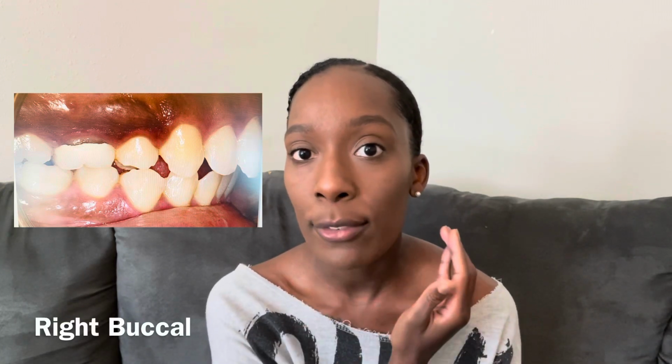In this image, it's really important that you're getting, starting from the cuspids to the second molar, so you can see everything. Sometimes it's really hard to get that shot, so we do have cheek retractors that are shaped this way so you can pull all of the cheek back to get that full buccal shot.